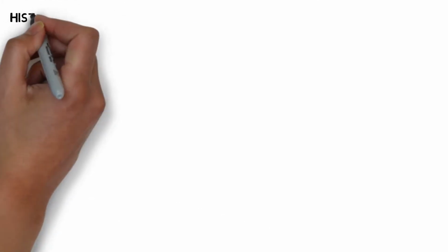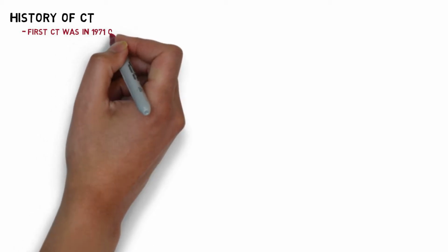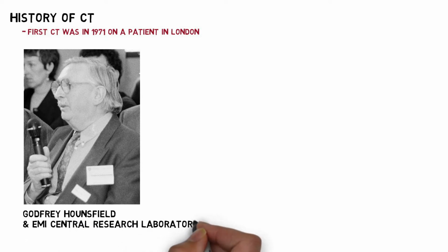The first CT scan occurred in 1971 on a patient in London with a frontal lobe brain tumor. After about 80 years of research, since the first X-rays were used in the 1890s, Godfrey Hounsfield and other researchers at EMI Central Research Laboratories developed this new type of bioimaging that combined X-ray imaging with computing.